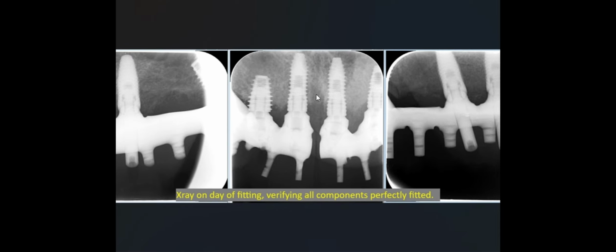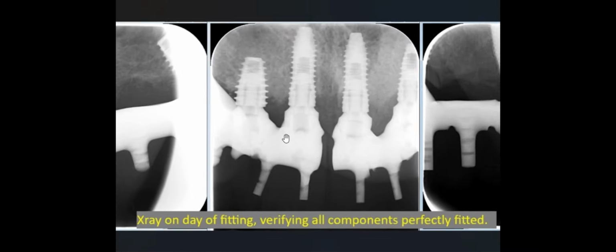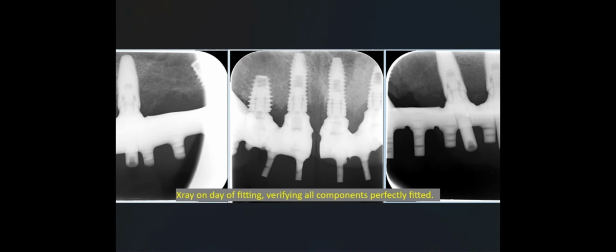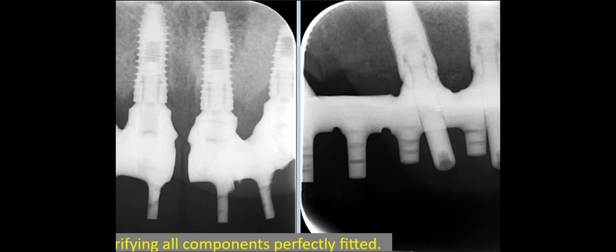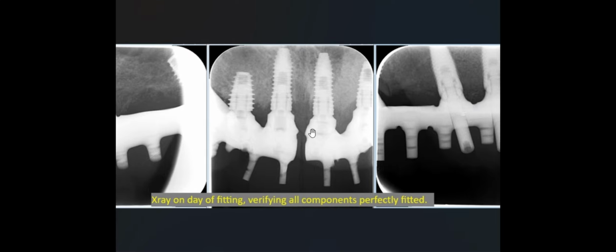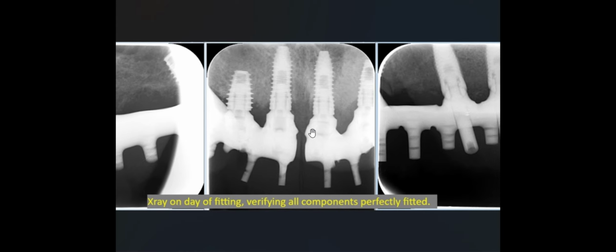What you can see is these are the original implants done by the other dentist, and there's a short front one, and these are the components here that we've had to utilize to change the angulation. Whereas we went direct to fixture or direct to implant, here the components are milled out of titanium as one piece and directly screwed onto the implants. So you can see the fit is very accurate. There are no spaces and gaps. So very good result for the patient. The patient was very, very happy.